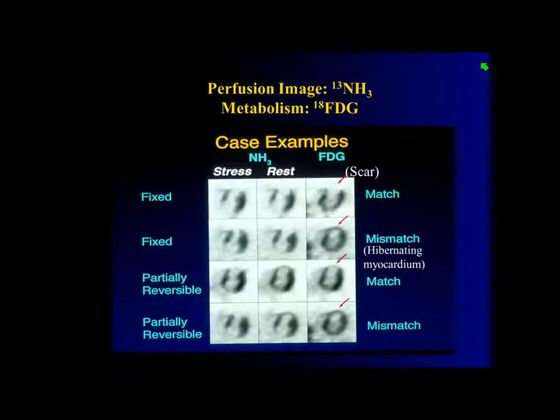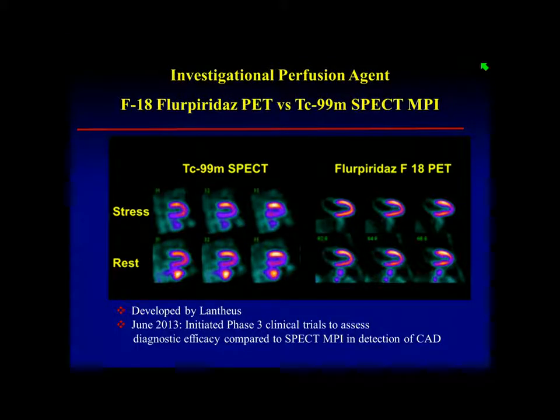And with this one, same thing, perfusion defect, but then we have the FDG where there's actually uptake into the myocardium. So we know we're just looking at hibernating myocardium. So again, we have recently just done a few of these studies, but not up on our PET-MR.